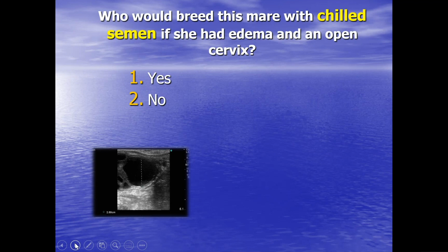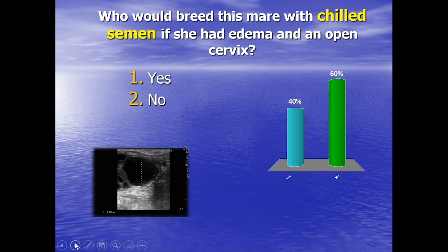That's 24 hours on. So 24 hours could see a big change in this follicle. It may be very, very close to ovulation. It may have changed shape even more, may have grown a little bit. But we haven't really got that option, because we're going to have to make a decision whether or not to order the semen for the next day. So it's tricky. This is a more tricky situation.